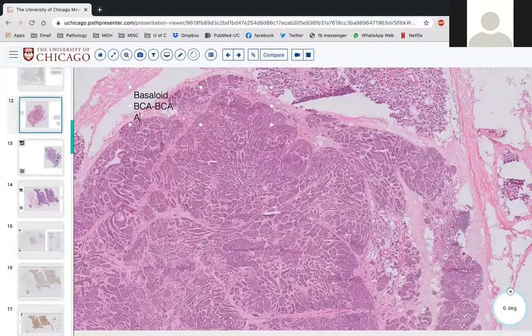Adenoid cystic. And our favorite mimicker, right? A cellular pleomorphic adenoma. So those are the three main ones we're going to be thinking about when you see a basaloid neoplasm. Just remember that for the basal cell neoplasms, it's not basal cell carcinoma like in the skin, it's basal cell adenocarcinoma. So just terminologically, just to point that out. Okay, excellent. So that's kind of what we're thinking.